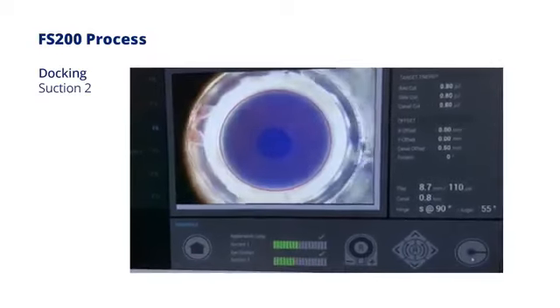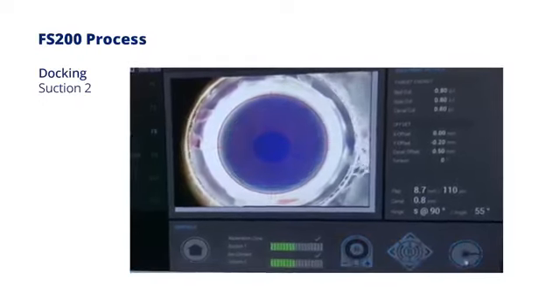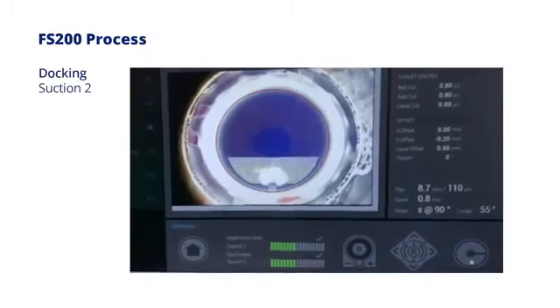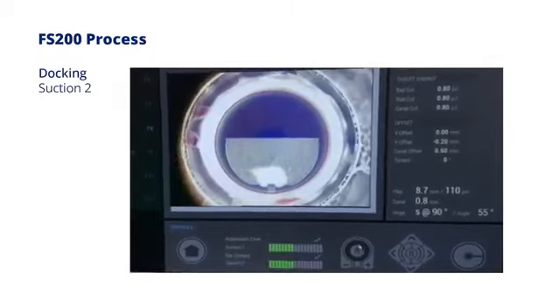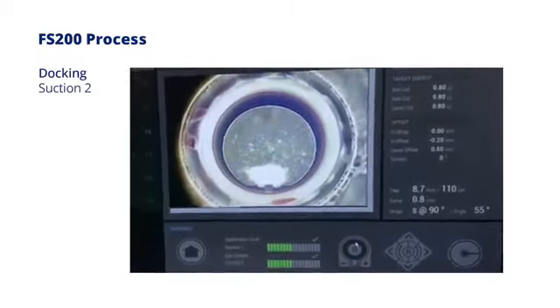The vacuum tool will be activated automatically. After the cone of the gantry pushing upward, the green light will finally appear after the appropriate contact of the cone and suction ring.